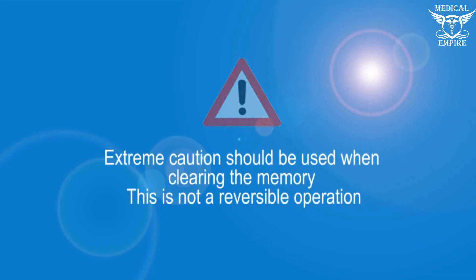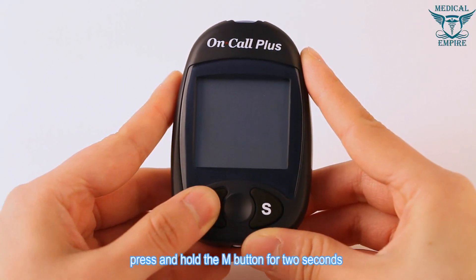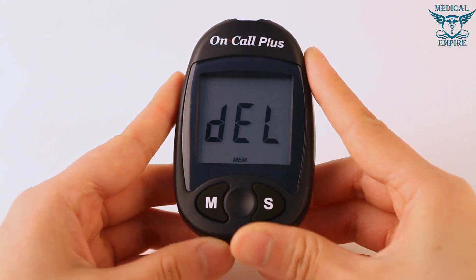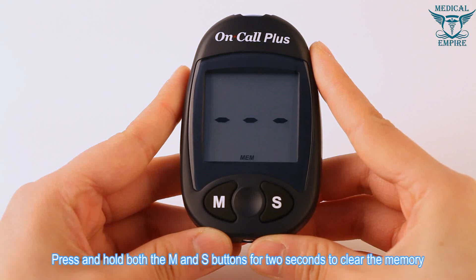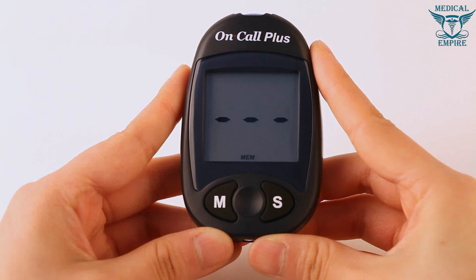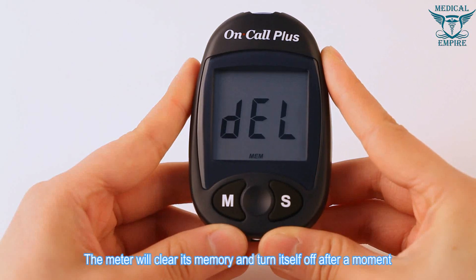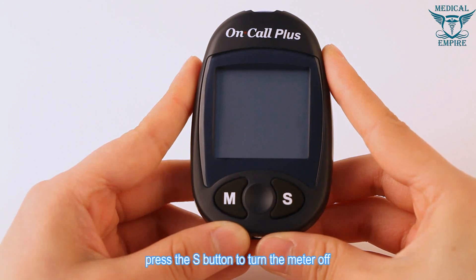Clearing the memory: extreme caution should be used when clearing the memory, as this is not a reversible operation. With the meter off, press and hold the M button for two seconds to enter delete mode. Then press and hold both the M and S buttons for two seconds to clear the memory. The display will show MEM and three dashes, and the meter will clear its memory and turn off. If you entered delete mode but want to exit without deleting, press the S button to turn the meter off.